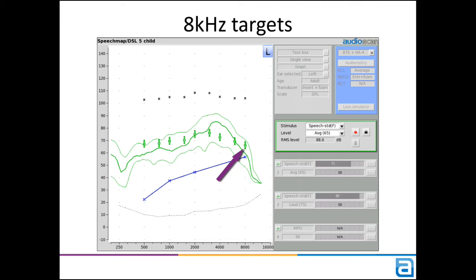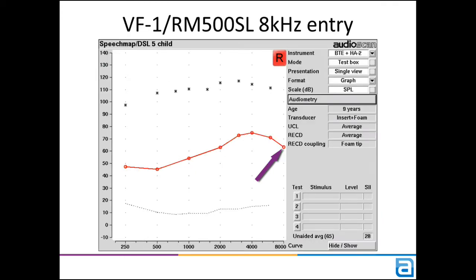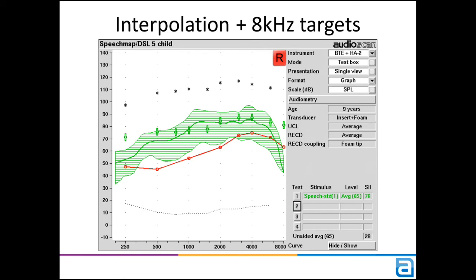This has been implemented across all AudioScan models, and it's meant some additional changes. Verifit VF1, Axiom, and RM500SL previously did not accept audiogram entry up to 8 kHz. This is now required in order to provide the fitting targets at this frequency. Here's what the legacy Verifit screen now looks like with target interpolation, 8 kHz audiogram entry, and 8 kHz DSL targets.